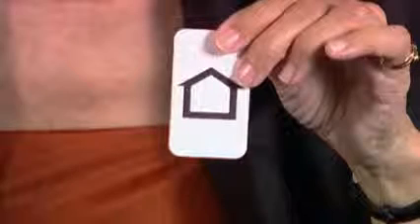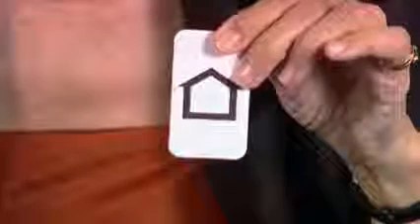Nowadays children can see this form as the arrow that is related to the mouse of the computer. If the child cannot use names or signs, then we can use matching. And this is one of the best matching surfaces. So then I would ask the child either which picture do I now have in my hand, or on which picture would you like to put this on? And then we see the child putting it on the correct one.